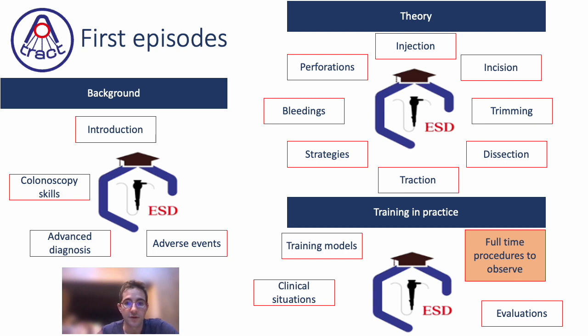So here you can see the different parts of the ESD School we want to share with you, and in this one we will see a full-time procedure like an observation. The difference with real life is that you don't see my hands, you don't see how we proceed, you don't see the nurse, but at least you will see all the steps and all the difficult parts of the procedure.